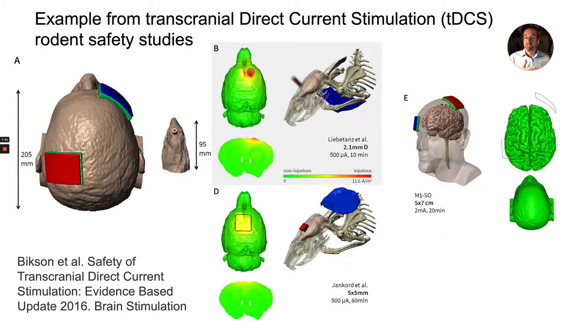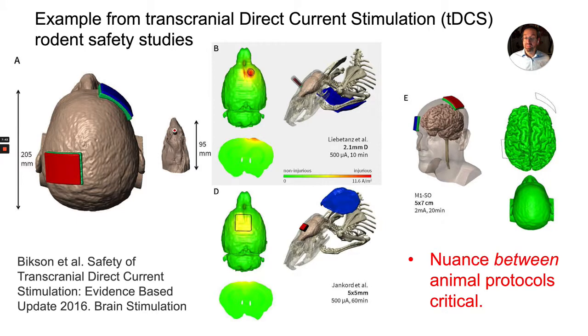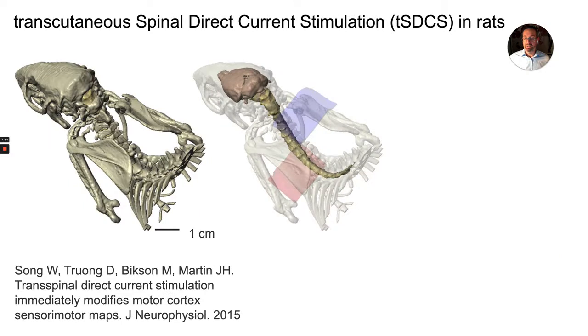This emphasizes this notion of scaling and how we need to think about scaling when going from animals to people, but equally thinking about specifically how we dose in the animals and how small differences in dose in animals can also have this impact.